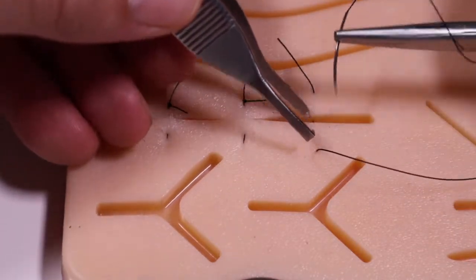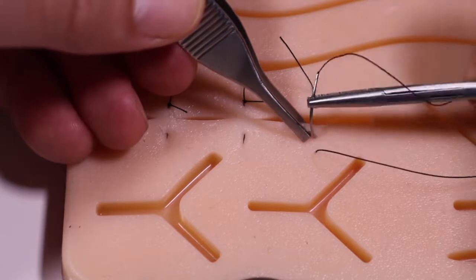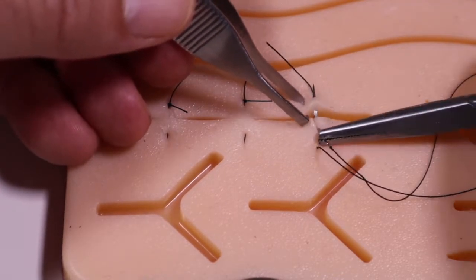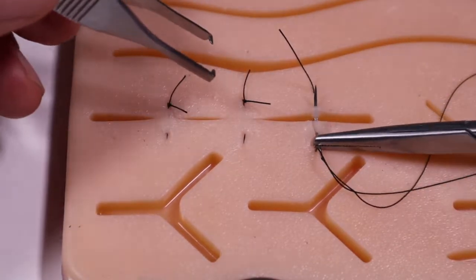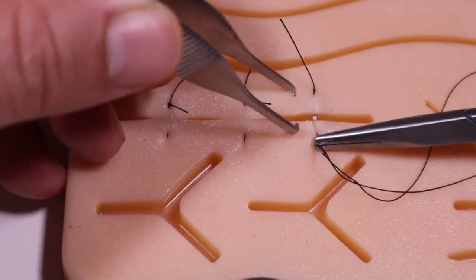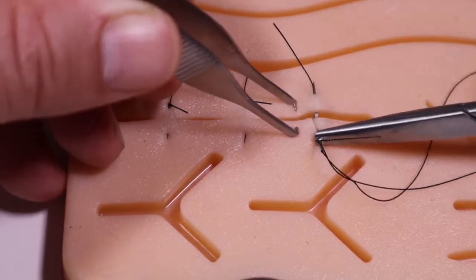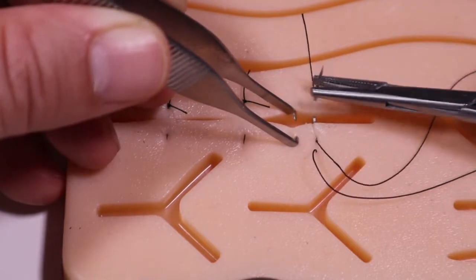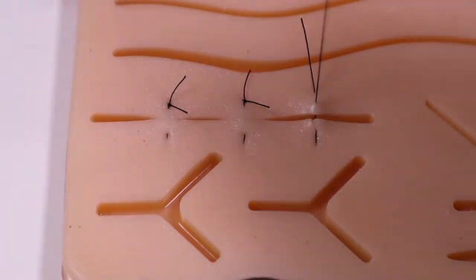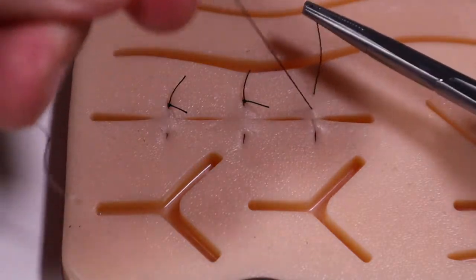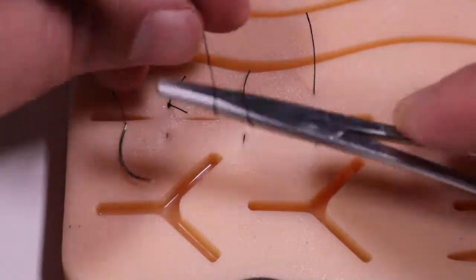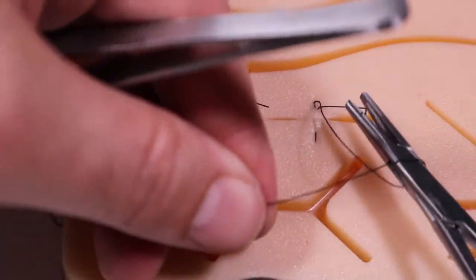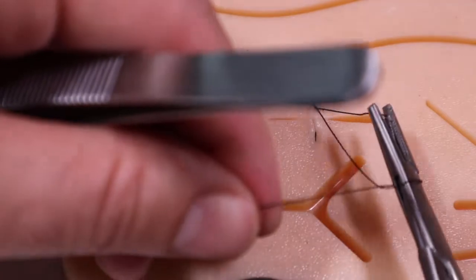We're going to reverse for our backhand and just roll that needle through. Two forward throws, reverse and forward.